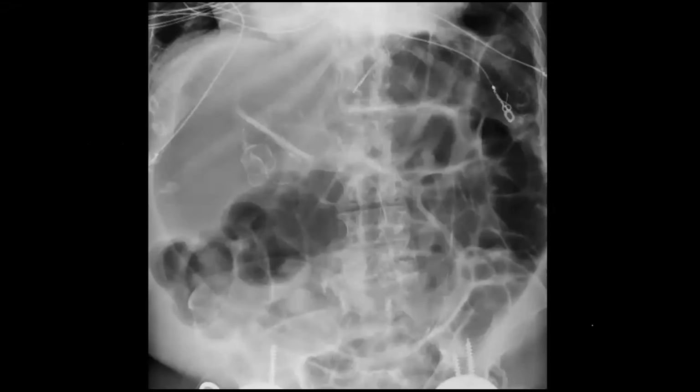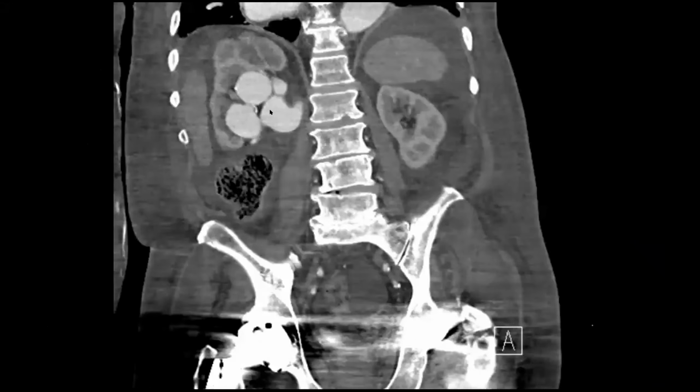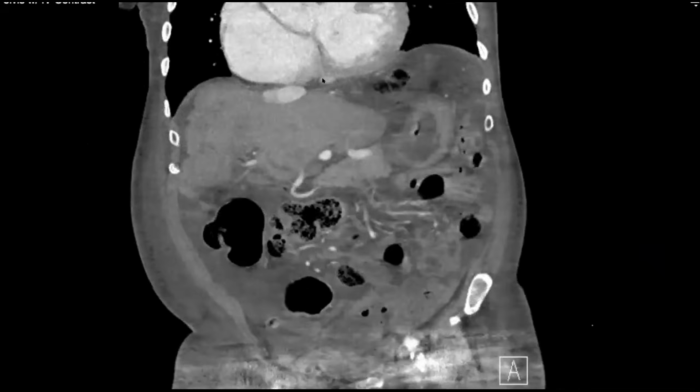Yvonne, do you have any comments? I was just showing this case of these mysterious calcifications on this plain film. We were thinking gallstones, liver, eventually got to kidney, and then had this patient with this huge AVF that we thought was causing maybe high output cardiac failure.